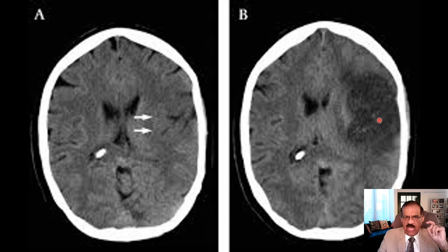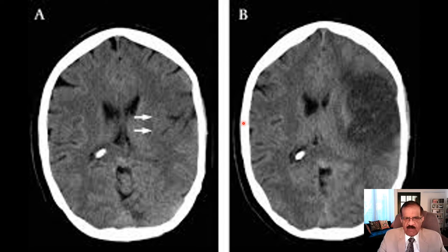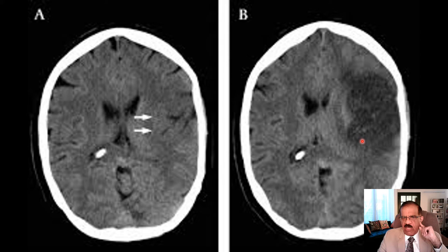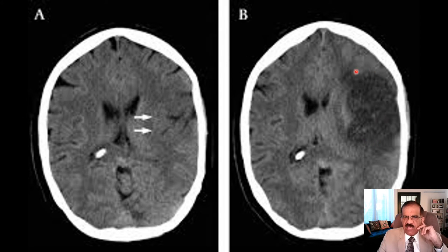Before describing the abnormality, you first have to orientate yourself. When you see a CT, it is as if you are looking into a mirror — this would be the right side although it is on your left. When we describe this opacity, it is on the left side. Since this patient had right-sided hemiplegia, this left-sided lesion correlates with the right-sided hemiplegia.